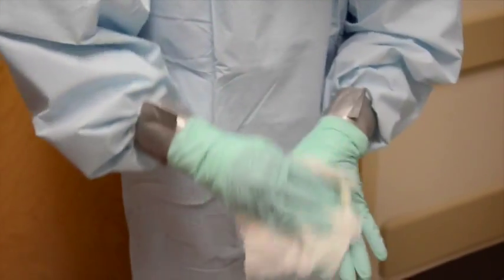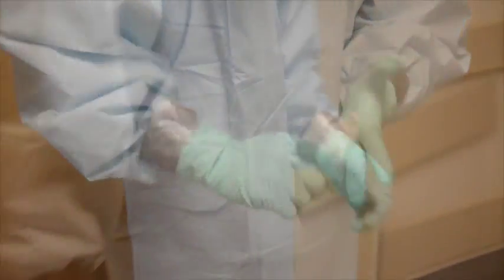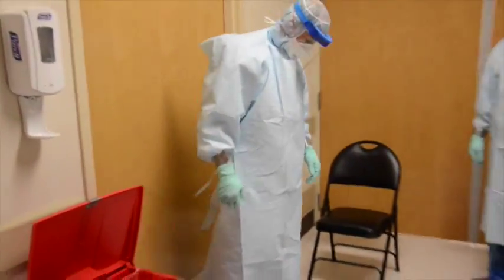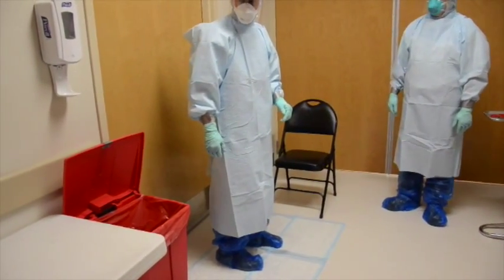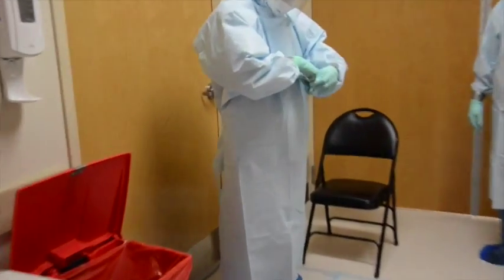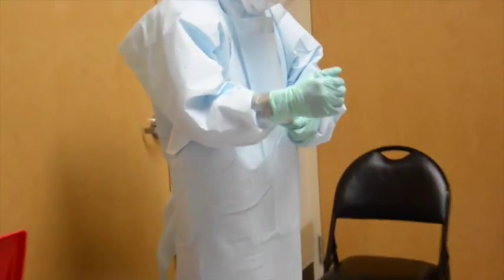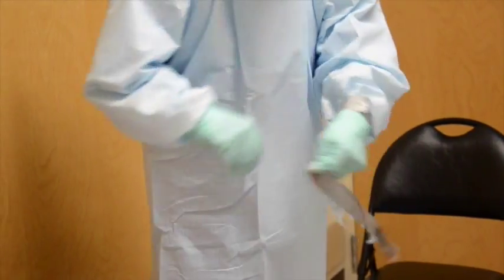Bleach wipe outside of long-cuff gloves to remove contamination prior to leaving patient room. Exit room and stand on doffing pad. This is used to collect and reduce contamination outside of the room. Remove tape from glove cuff and gown by pulling gently on tape. Discard tape into red waste container. All PPE will be discarded in the red bag waste container.